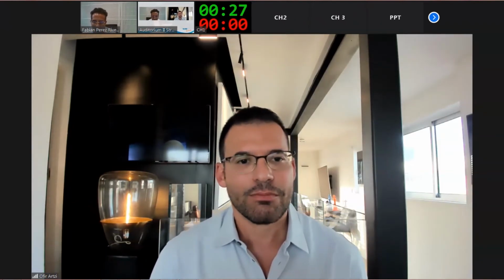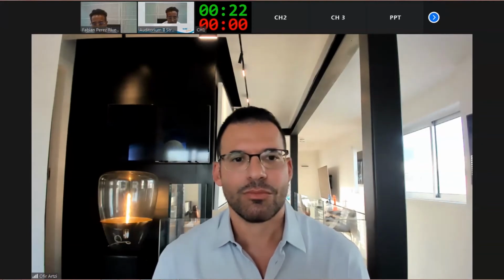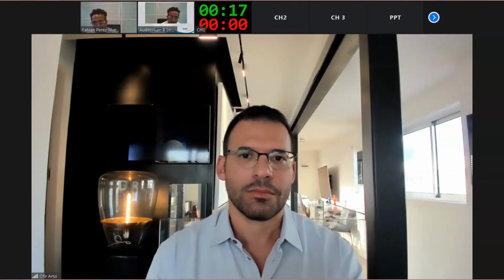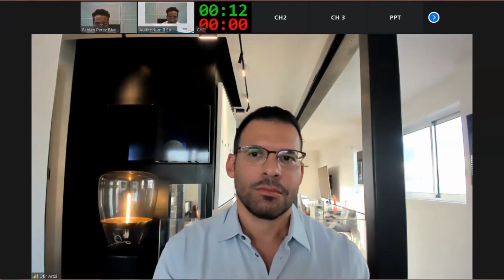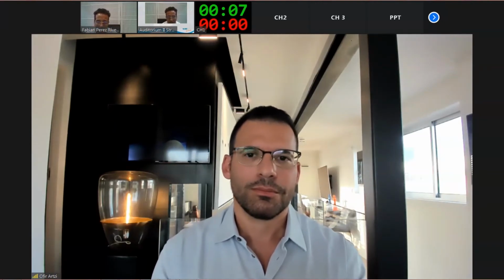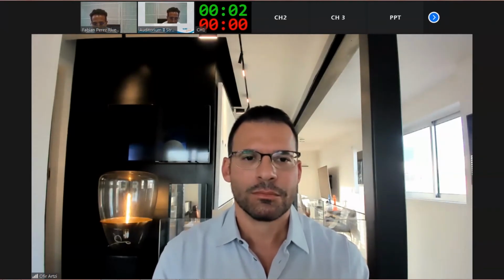Okay, thank you so much for the question. Well, for the first question, I'm aggressive, as you see here on the screen. I use 120 millijoules. That's why I often obtain a prolonged PIH, but it's no matter for me. I know that it's going to happen. That's why I wait at least 3 months in between each session. As you can see on the screen, the result of my patient is good enough to resolve a great amount of the scars in the patients.